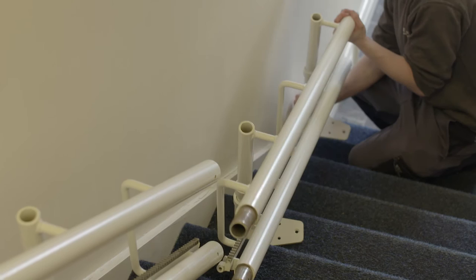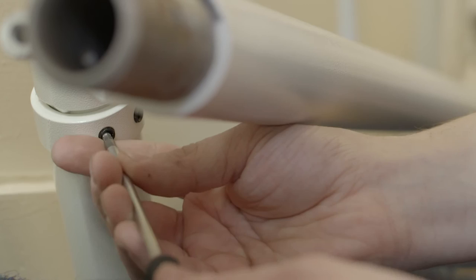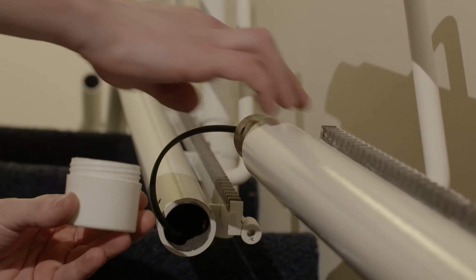Adjust the rail sections and bases to approximate height using the installation drawing. Gently tighten the grub screws on each base. These will need to be adjusted later.